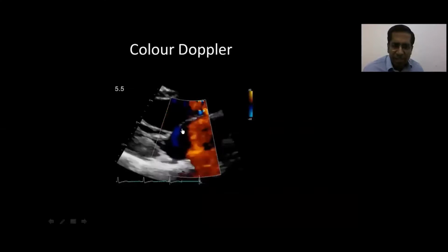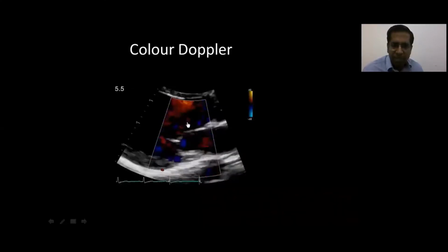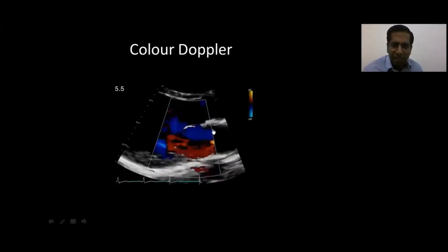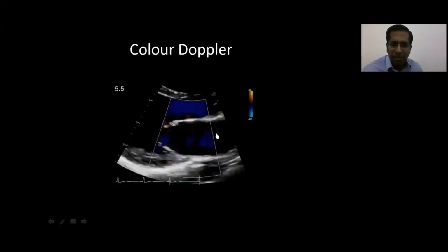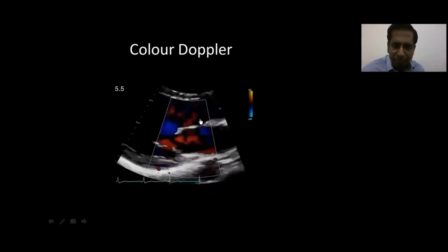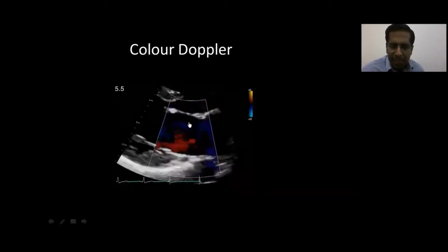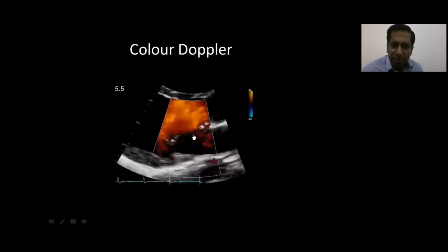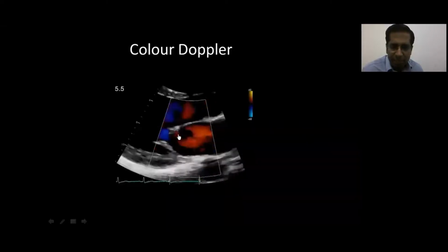Obviously, seeing just the mitral valve leaflets with so many pixels would definitely give you a better image. This is slightly different from magnification, wherein you may lose pixels by blowing up the image, but that is just a technical point.